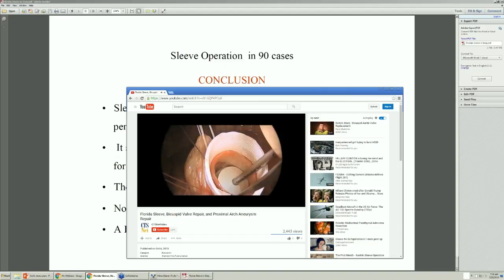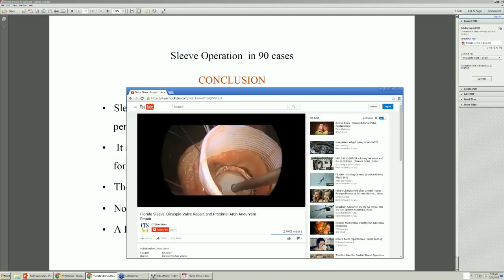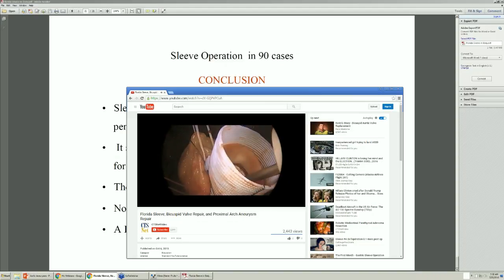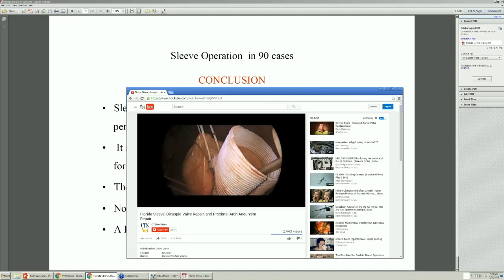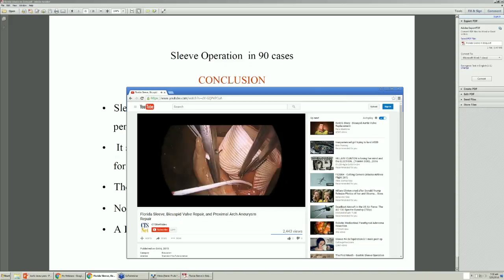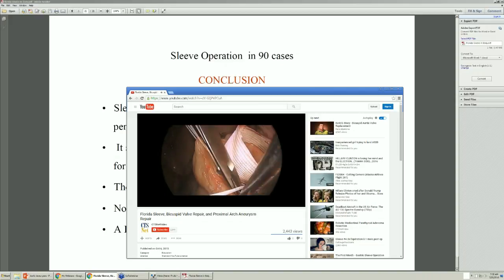Here we're placing a 27 millimeter valve annular sizer dilator because the annulus itself is slightly larger than this, around 29 millimeters, and we wanted to reduce this annulus slightly because of the aortic insufficiency and give ourselves an opportunity to build leaflet height in the conjoint leaflet, which is likely contributing to the eccentric aortic insufficiency. Both under the right and left coronary arteries.